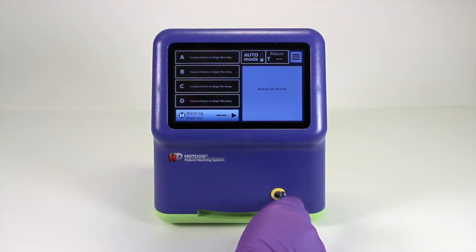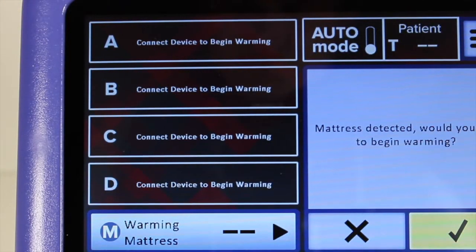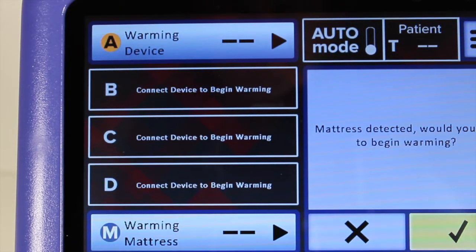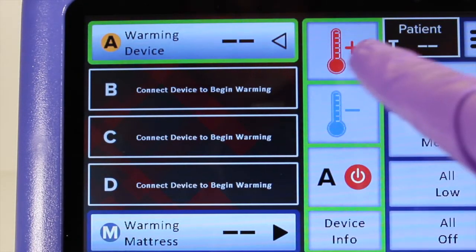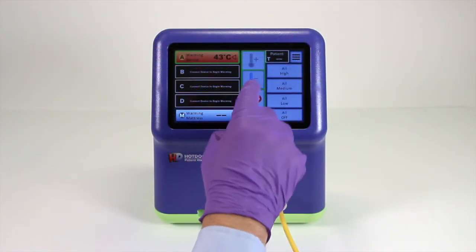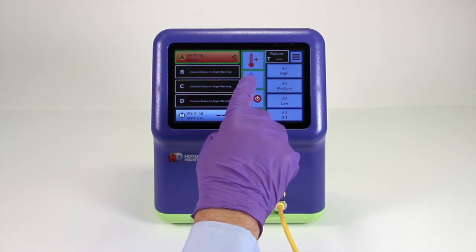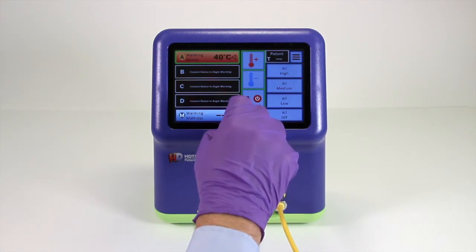Let's connect a mattress and a blanket to see how to control warming devices from the touch screen. When a device is plugged in, the corresponding port letter icon will be illuminated. Touch this icon and then the red thermometer to increase the temperature setting — it will select the maximum temperature when first touched. Lower the temperature by touching the blue thermometer.